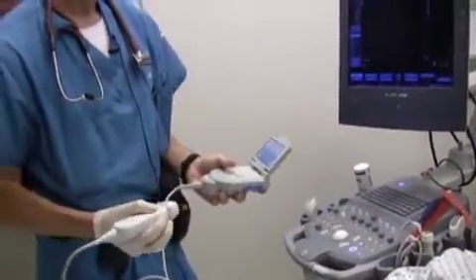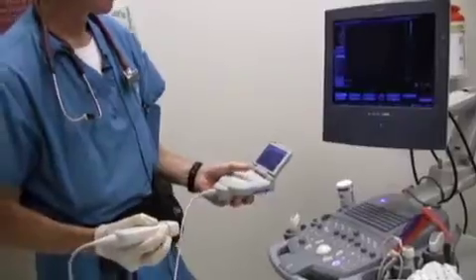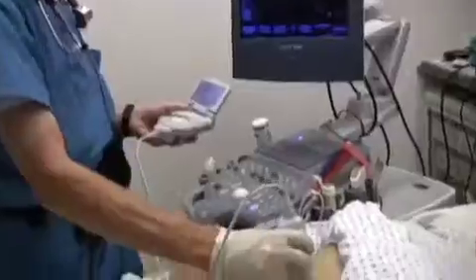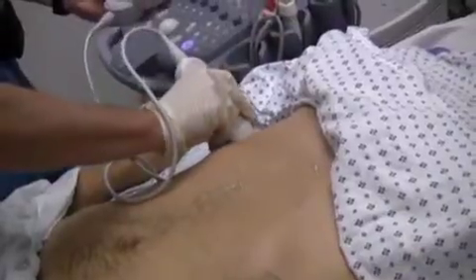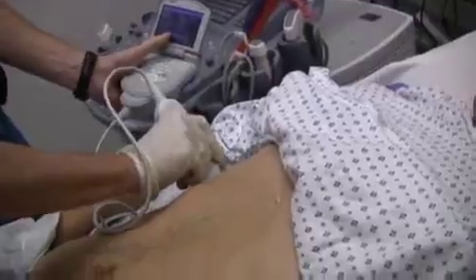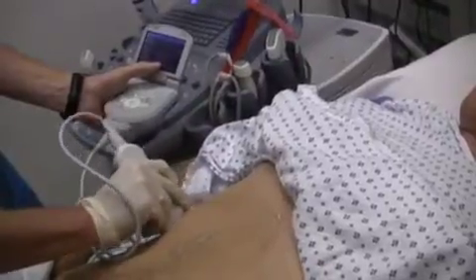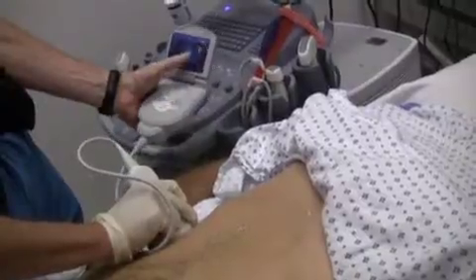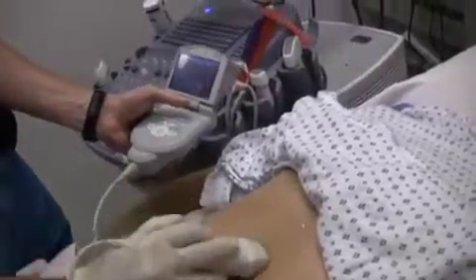This machine is now booted up — just by opening the lid it turned on. Starting from the beginning in real time, we're going to start in the right upper quadrant. We can evaluate the pleural space right here above my thumb, backwards and forwards. We can see the superior pole of the kidney in Morrison's pouch right here. The inferior pole of the kidney is quite nicely seen right here with the psoas muscle right behind it. That's the complete right upper quadrant.